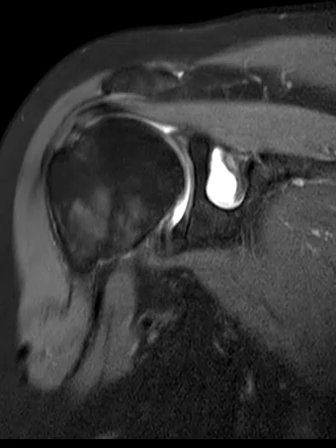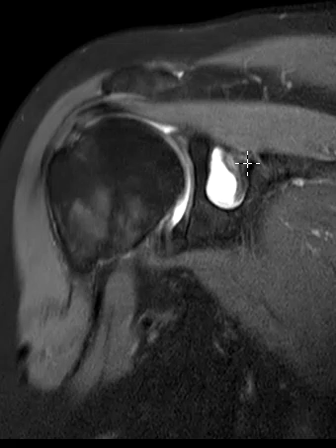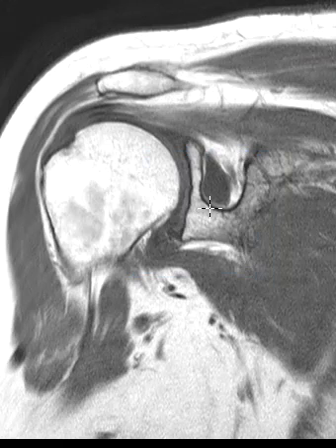This is a 66-year-old female with right shoulder pain, and we see this obvious finding here. This is in the spinoglenoid notch. We see a fluid collection that is expanding the notch. Here's another view of it.